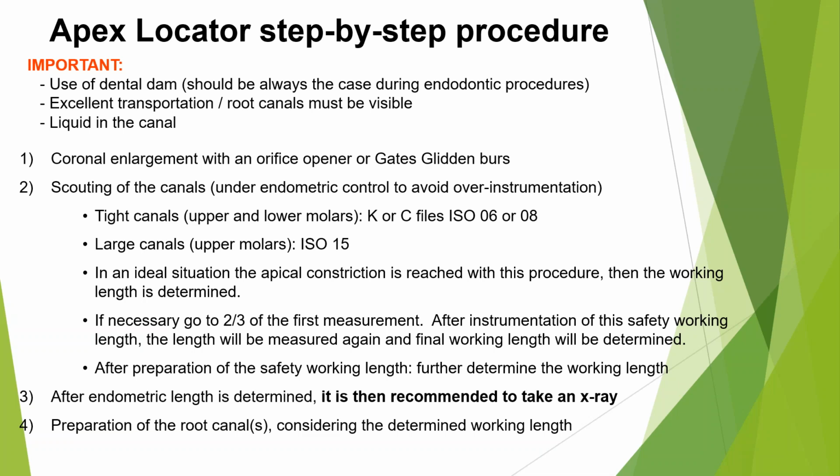You just go through it. You need to unplug it so that it does recalibrate. You don't want it to have the memory of the last tooth that you worked on. Nice. Then once the new tooth comes up on the screen, then you plug it in. Yes. All right. Okay. Great point. Thank you, Meredith.